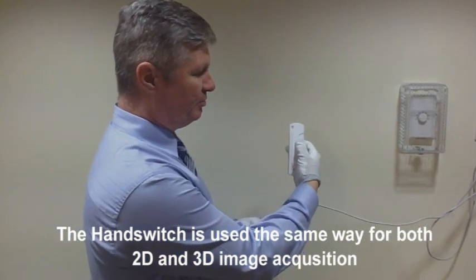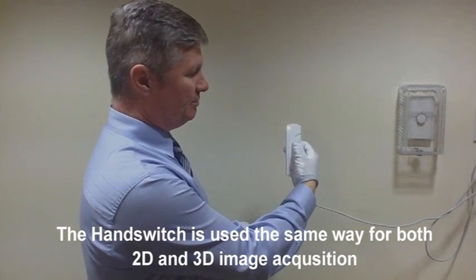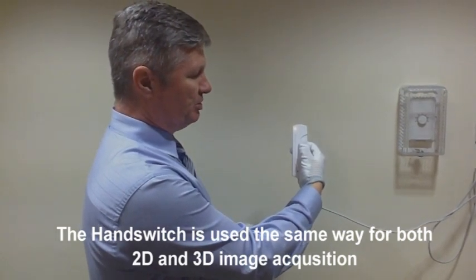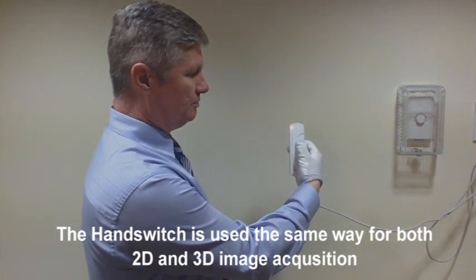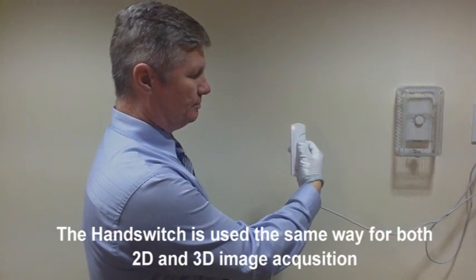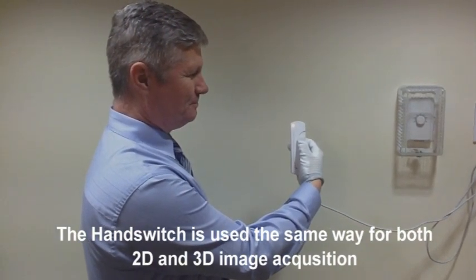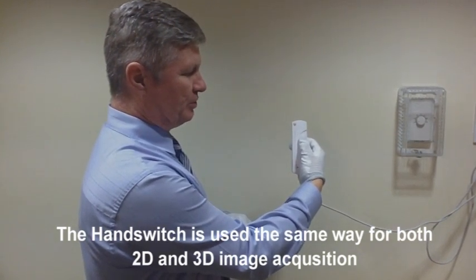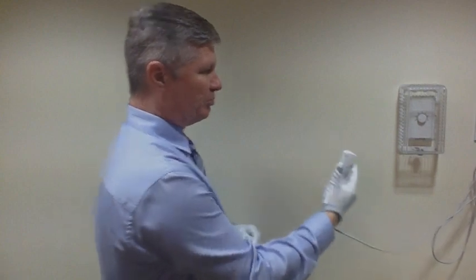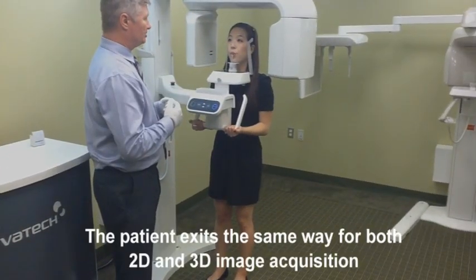I'm going to press down firm on the button itself and make sure to keep equal pressure the entire time. When the light turns orange, it means radiation comes from the device as it's rotating around the patient. When the light turns off here, it means we're done. Release our pressure and put the cradle. At this point in time, we're now done taking our CT scan.